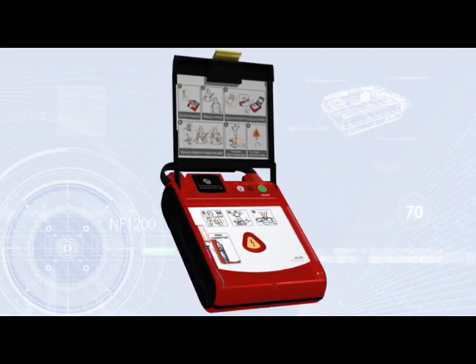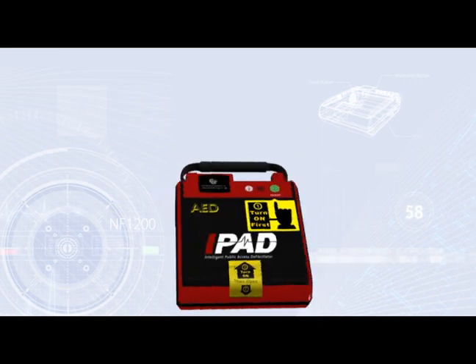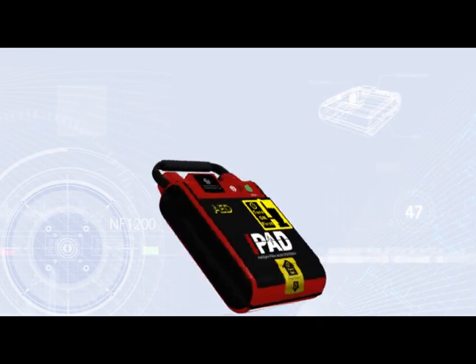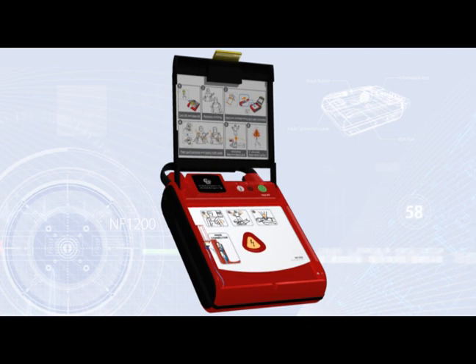This is done whether there is an error detected during the weekly test or not. During daily and monthly tests, if an error is detected, the error description is transmitted right away to the administrator. The daily tests include checking the state of the device battery pack. Thus, the administrator can fully maximize the availability of the devices deployed in the field for use in responding to emergencies.